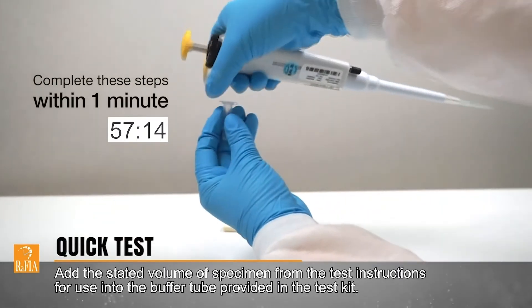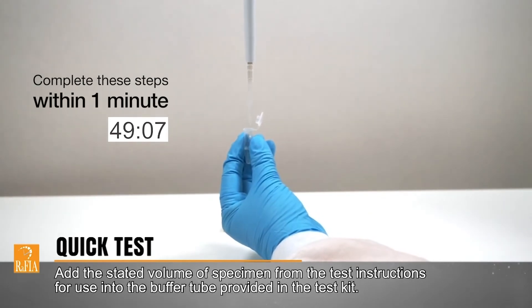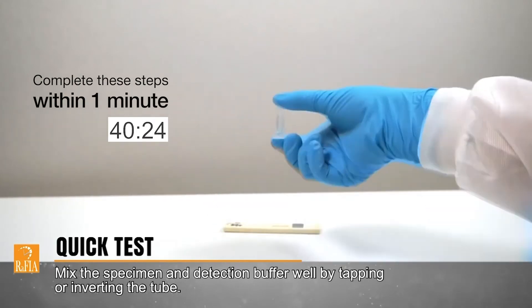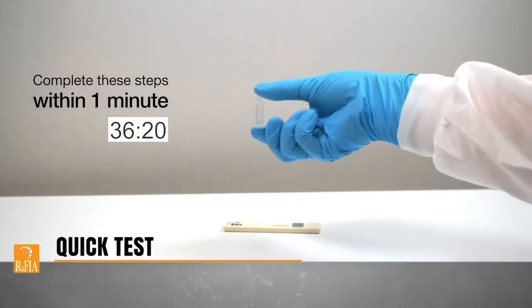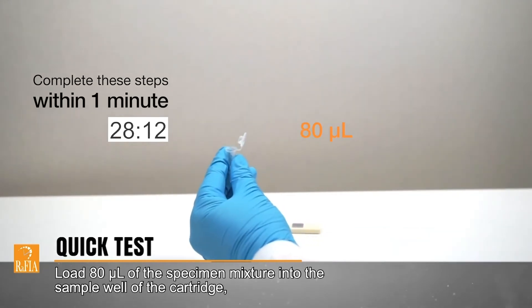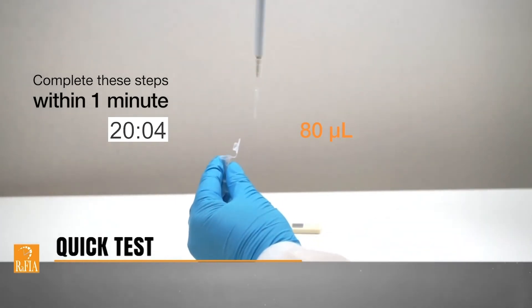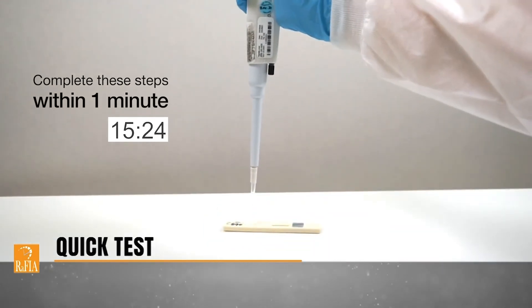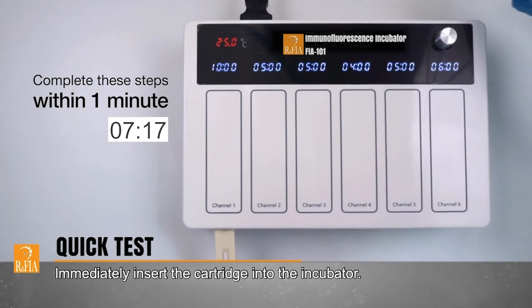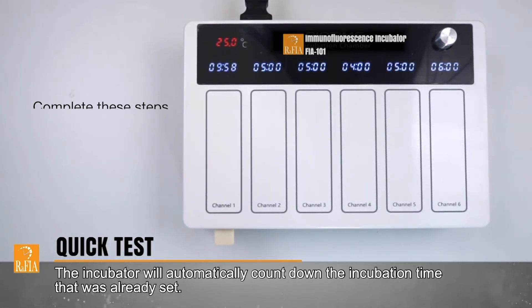Add the stated volume of specimen from the test instructions for use into the buffer tube provided in the test kit. Mix the specimen and detection buffer well by tapping or inverting the tube. Load 80 microliters of the specimen mixture into the sample well of the cartridge, ensuring there are no air bubbles. Immediately insert the cartridge into the incubator. The incubator will automatically count down the incubation time that was already set.